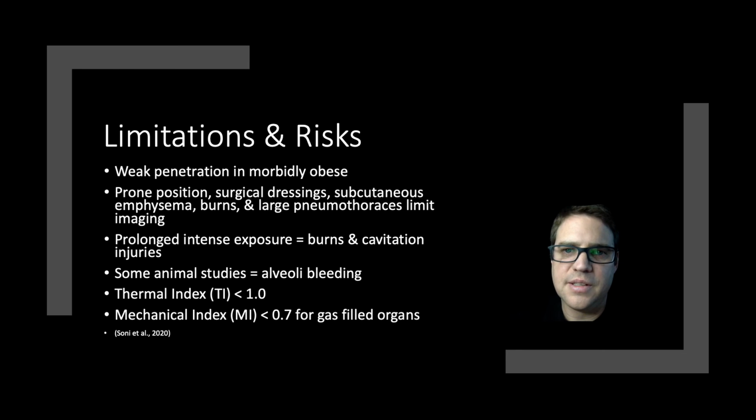Even though POCUS is an effective tool, there are some limitations and risks that the APP should be aware of. Like plain film radiography, ultrasound waves are weakened by adipose tissue, and POCUS has limited penetration in morbidly obese patients. Also, prone positioning, surgical dressings, subcutaneous emphysema, burn injuries, and large pneumothoraces can limit POCUS's imaging ability.